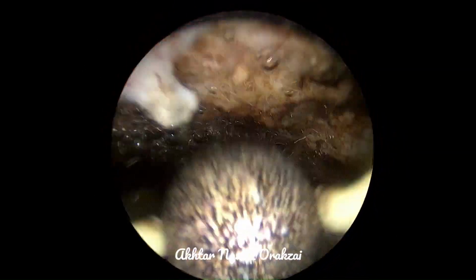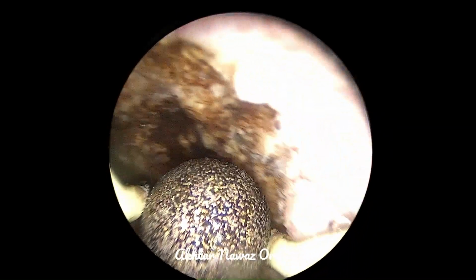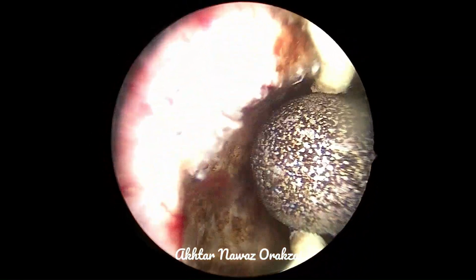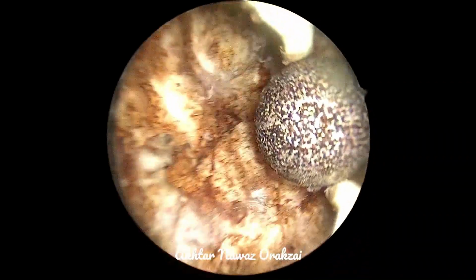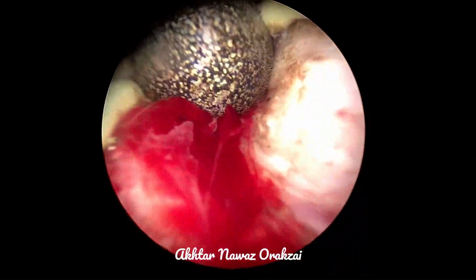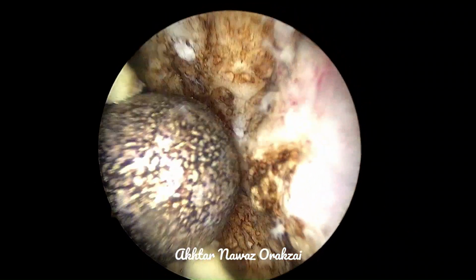So there is no need to take a risk with incontinence and stricture. I'm talking about these areas. These areas, if left alone, will be better, but since this is an educational video and we need to have a clear vision, that's why I coagulated them.